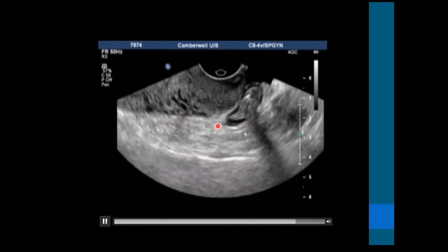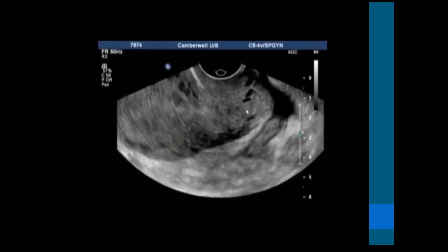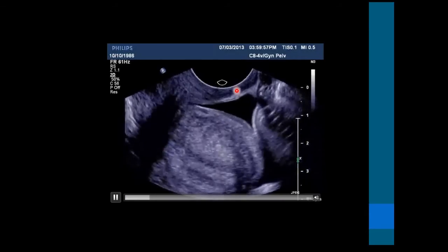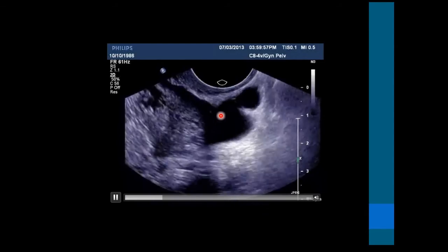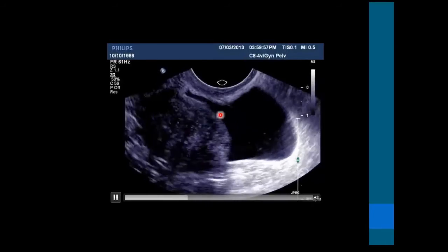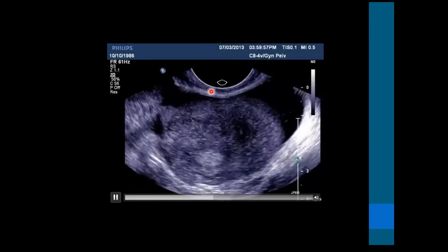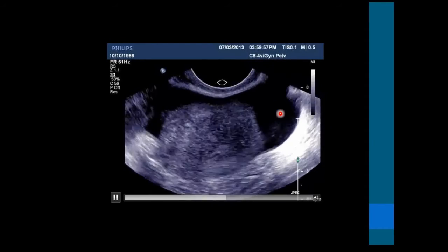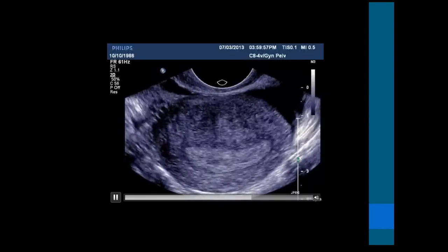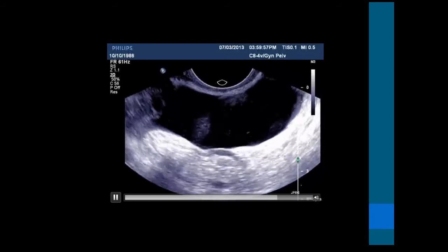And it is easier to assess when the uterus is anteverted, but it is also accessible when the uterus is retroverted. So here the uterus is retroverted, but there is some fluid. But what I do is I push on the fundus of the uterus and then suddenly pull back, as I did before, and you will see it again. So this is the retroverted uterus, and there is fluid everywhere. So this is clearly unobliterated in cross section here through the vaginal wall, bit of free fluid. So the posterior vagina is also not stuck to anything.